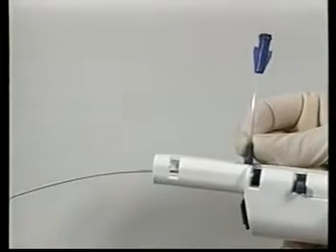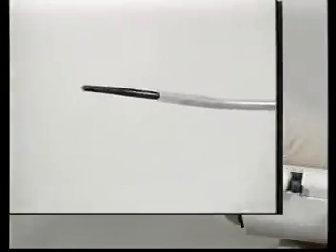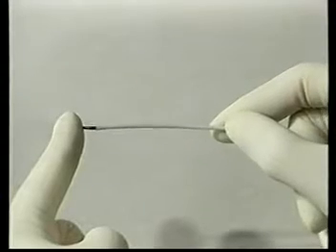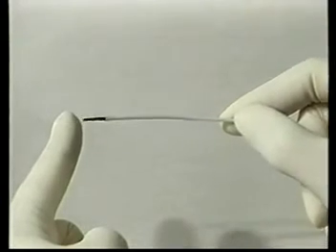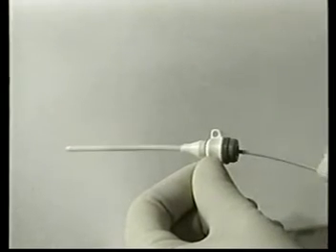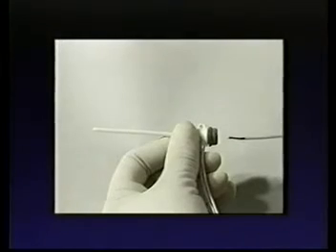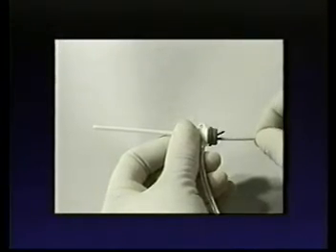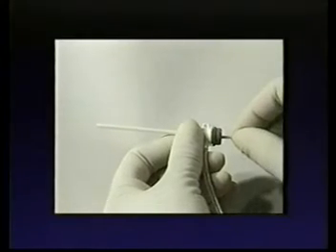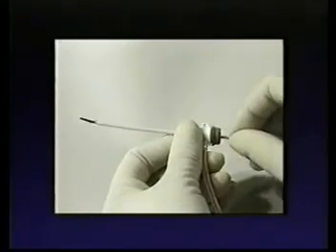Slide the side arm of the hemostasis hub forward so the outer sheath covers and compresses the fragmentation basket. The basket's plastic tip is soft and flexible. When inserting the device into the access sheath, you may choose to cover the catheter tip with the outer sheath. Alternately, if the tip folds onto itself as it enters the sheath valve, pulling the catheter back slightly will allow the tip to unfold within the hub for proper insertion.